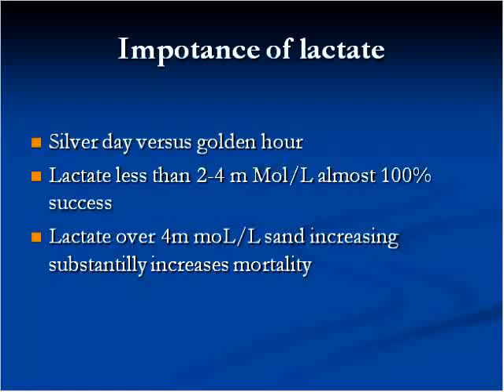Is there evidence on how much arterial blood you would feel comfortable giving, a minimum amount of arterial blood, I would say, to get a gas out to do an analysis?